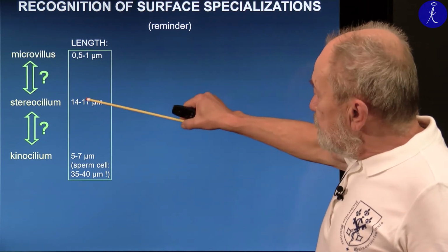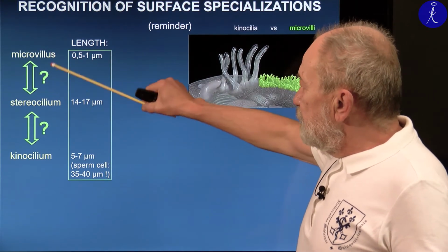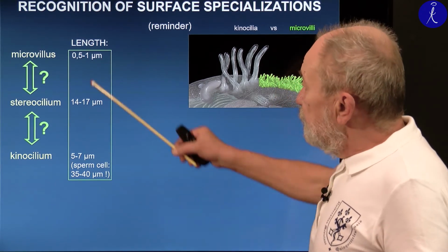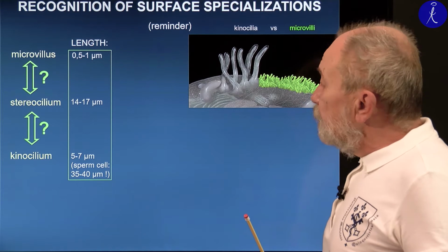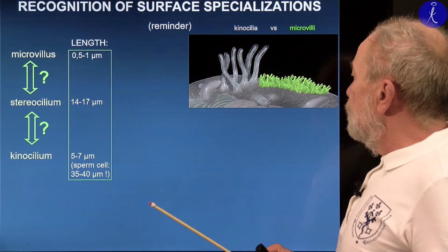Why this sequence came is that there are similarities between the first two, and the third is completely different from them, even if the length of them is not put in sequence.